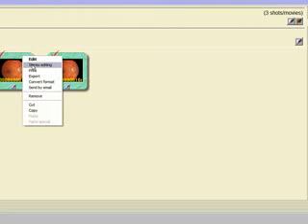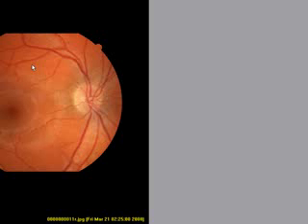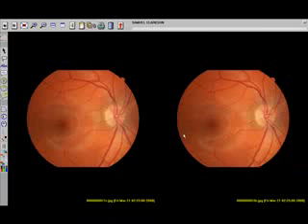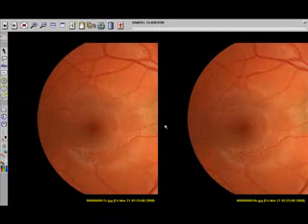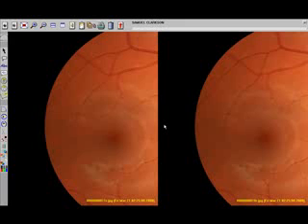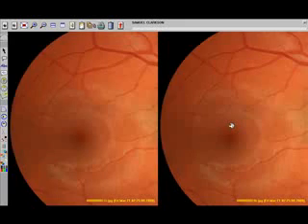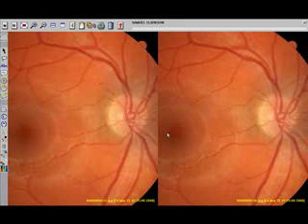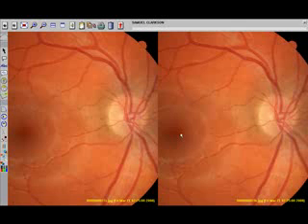To compare images side-by-side, hold the Control button down on your keyboard, right-click on either frame, and left-click Stereo Editing. You can zoom the images by scrolling your mouse wheel, and you can adjust an image by holding the Shift key down and moving the image up and down in order to get even orientation.